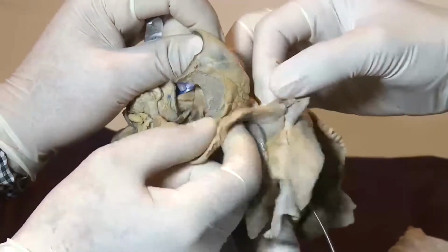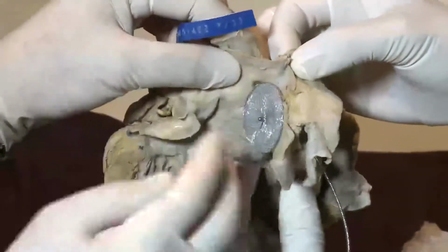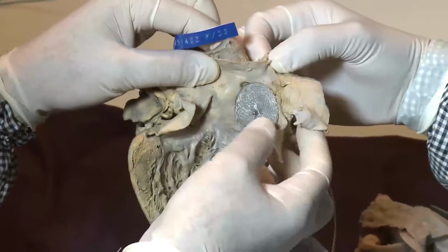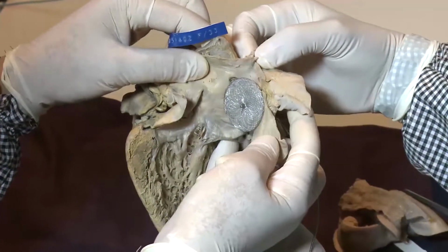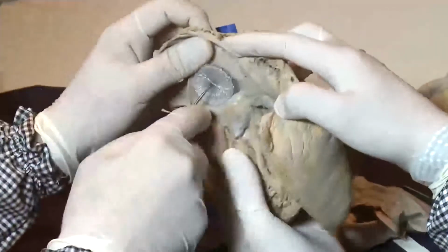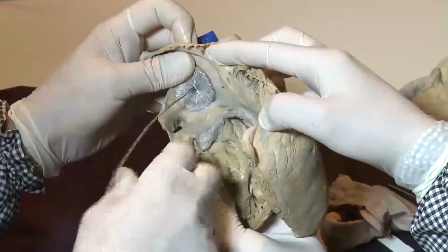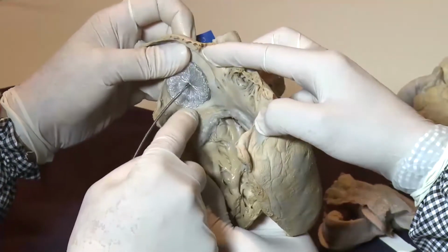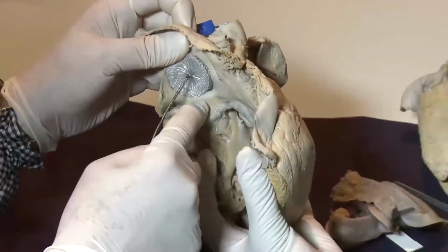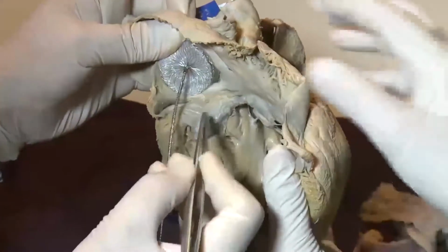This is very thick. Actually the incidence of erosion is very rare, but if it occurred, it can be a serious complication. So just emphasize the importance of the rim length. I have experienced 2 cases of AV block after the device closure. If the inferior rim is too short, it may touch the AV node.